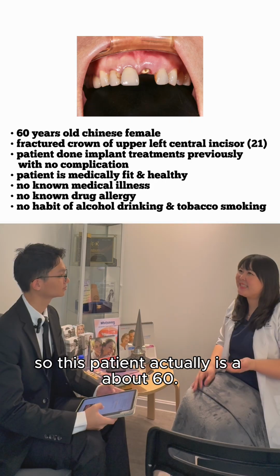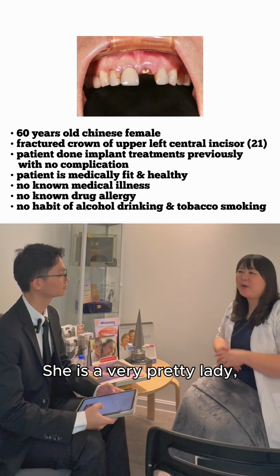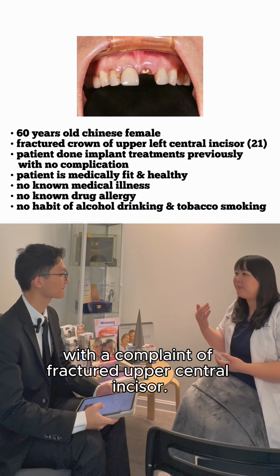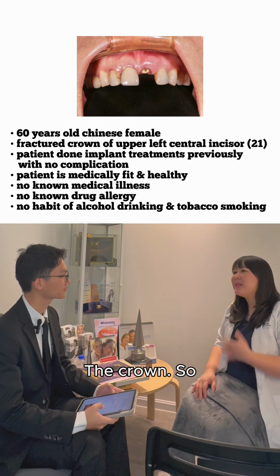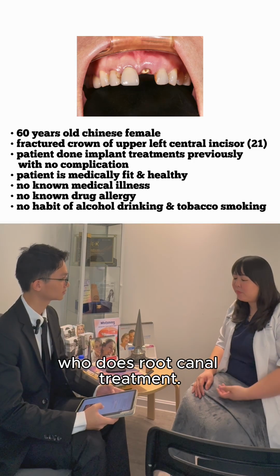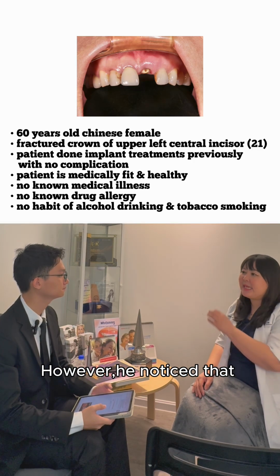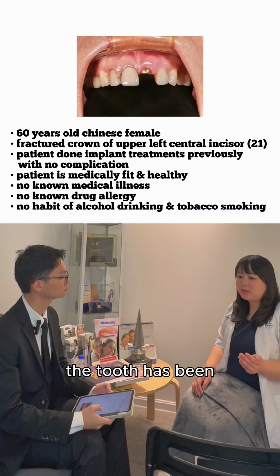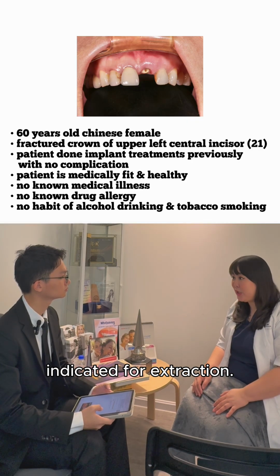So this patient is about 60. She's a very pretty lady. She came to me with a complaint of a fractured upper central incisor crown. So I immediately referred the patient to my colleague who does root canal treatment. However, he noticed that there was not enough tooth structure, and therefore the tooth was indicated for extraction.